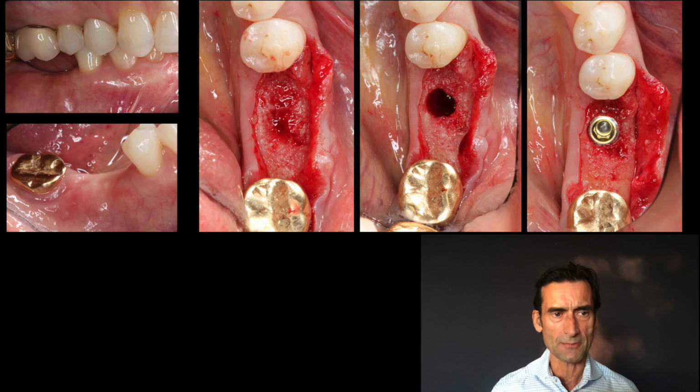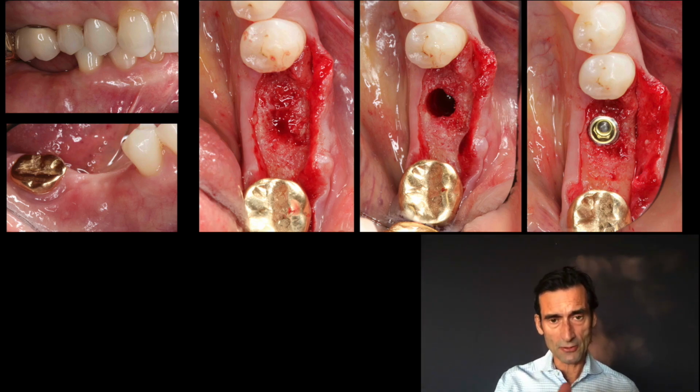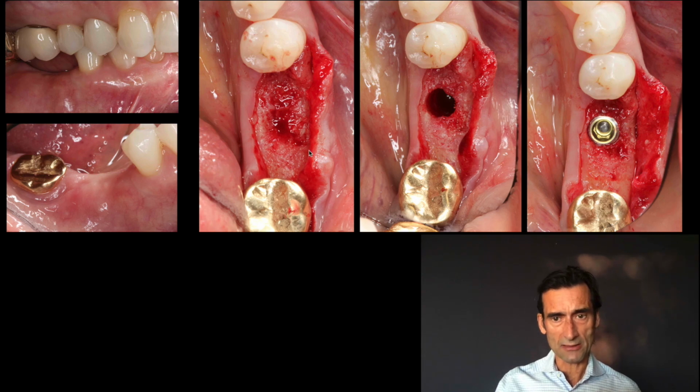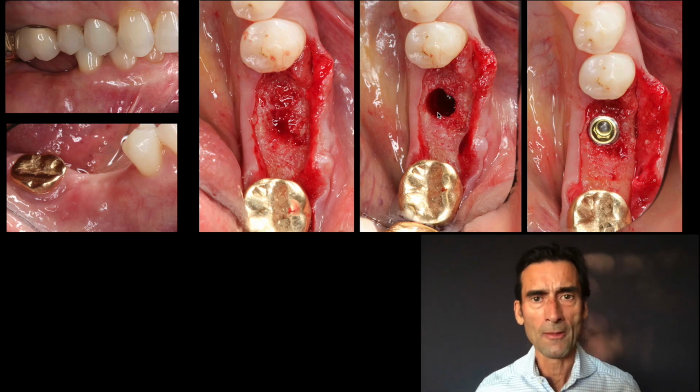Got a lot of bone here in this particular patient. I'll make the flap incision a little bit towards the lingual, always staying in keratinized gingiva, so I can displace the flap to the buccal. Now notice my incision is crestal around the tooth, the premolar and the molar, and then it's a full thickness flap. And then I follow the drilling protocol of the implant system that I'm using. Here I'll use a pretty passive implant. I'm not going to do immediate temporization. I go very nice and just normal routine.